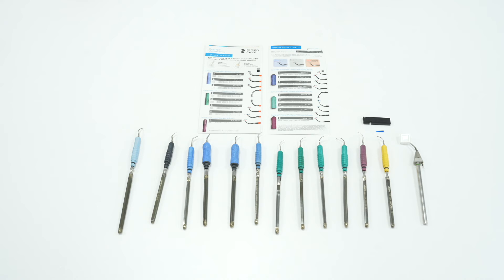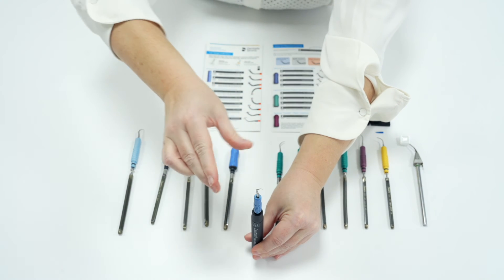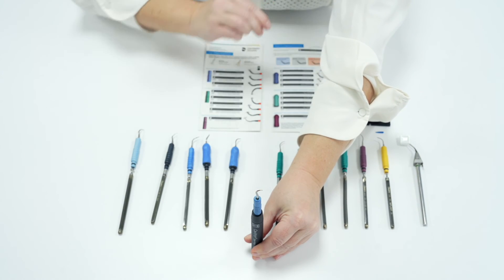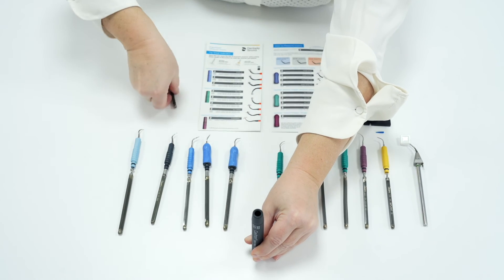If inserts are used on too high a power setting or on boost constantly, they can also overheat and wear down quickly or possibly separate. So look for the consistent drip and light hue to gauge what power and water amount to use. If an insert starts to heat up, remove the insert, make sure the stack is full of water and turn the power down — this should resolve the issue.